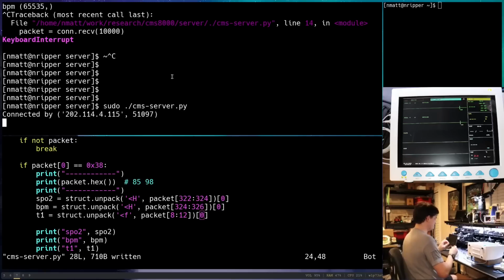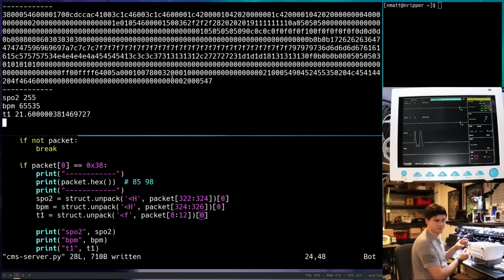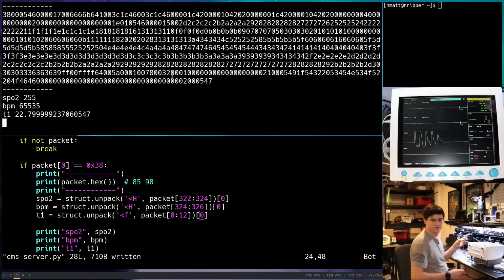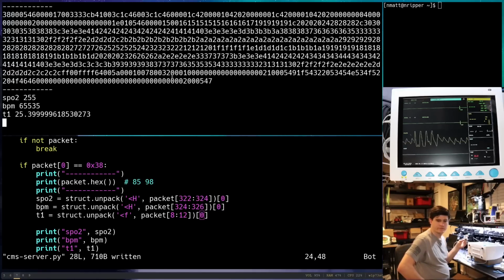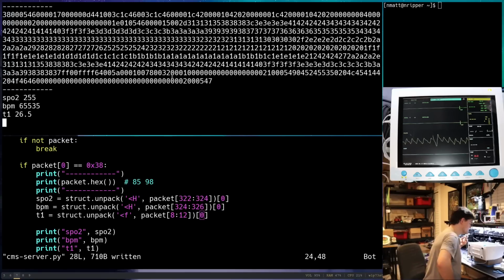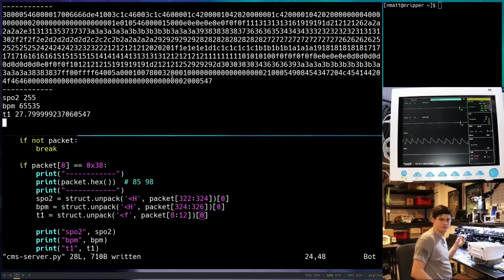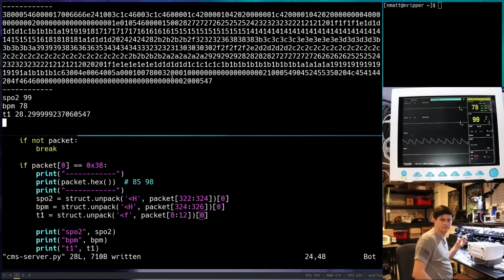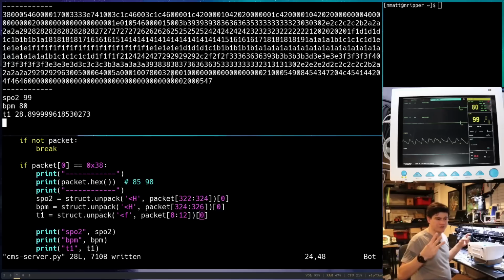All right, here we go. Starting it. And I'm going to hold on to the temperature sensor, and we're going to have the pulse ox on. Awesome. 26.5. Yep, looks good. It's heating up. And now we have our other values. So now we can capture all 3 of those values.